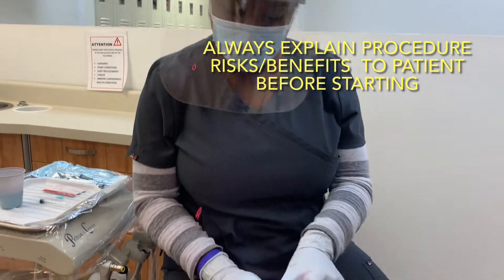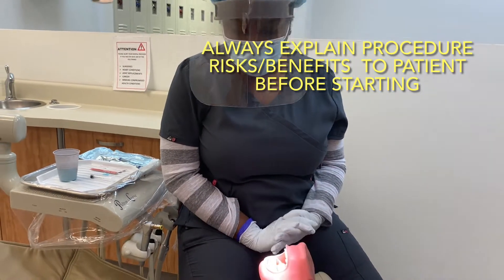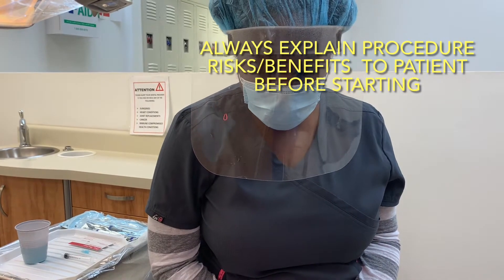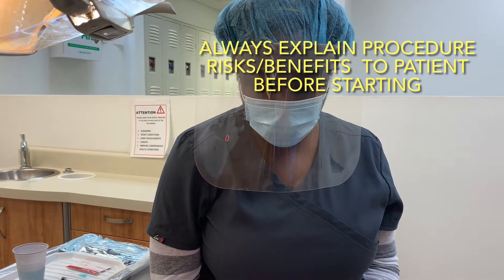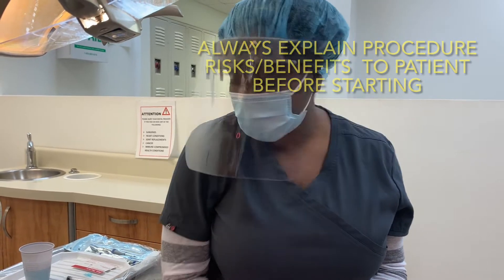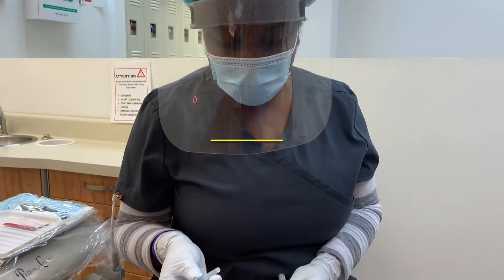Now I'm going to explain to Mr. Curtis what I am going to do. Mr. Curtis, I am going to use an agent called chlorhexidine for irrigation, because I just did scaling on you and your pockets are very deep. This is an anti-microbial that will flush out the bacteria and will help fight the infection that you have in your gum. It will not reduce the pocket level, but it will help.